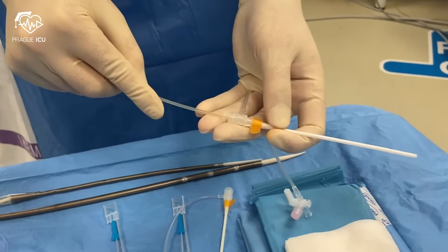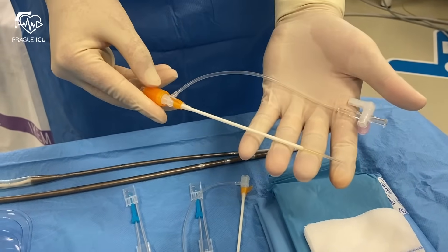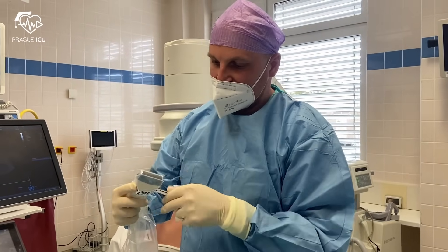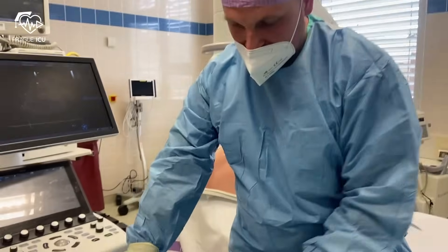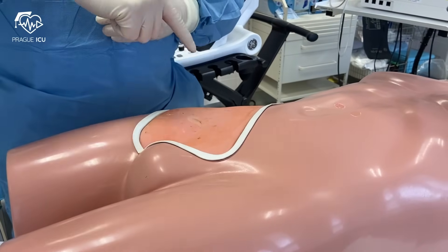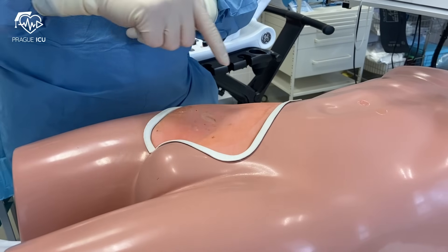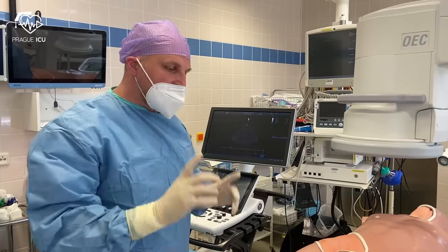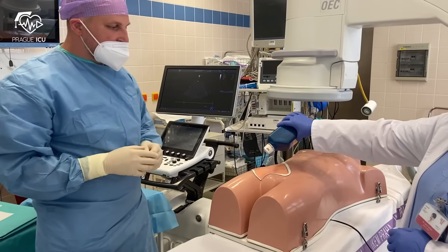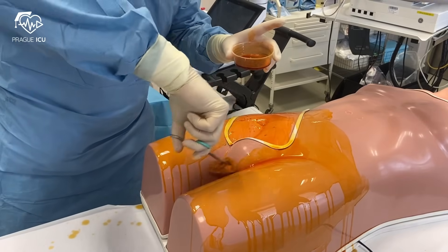We can perform the cannulation just with the components from the provided ECMO set, but what we prefer is to start the procedure of ECMO insertion with 7 French sheaths. The first recommendation for ECPR ECMO insertion is to prepare another extra sterile tray for the vascular ultrasound even before the patient comes to the ICU. In normal circumstances we insert the venous and arterial cannula in different groins. Our second recommendation for ECPR is to minimize the time loss caused by prolonged skin disinfection. In these scenarios the circulants undress the patient and then splash the cannulation sites extensively with disinfection.